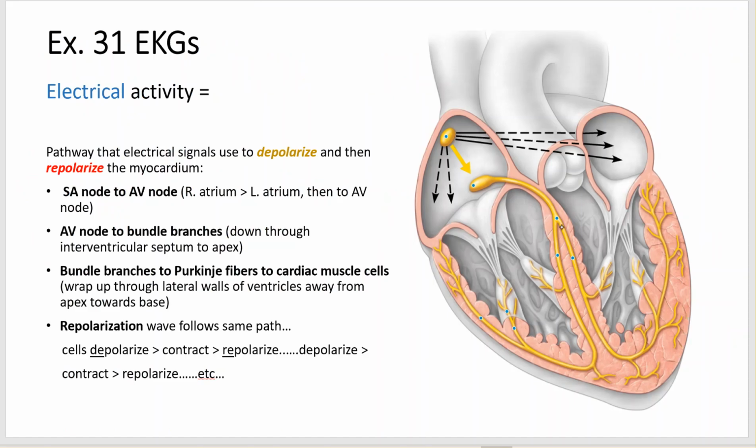So here we have left, oh, sorry, I don't want that. I want my pen. There we go. Left bundle branches. So if my signal is going down my left bundle branch, fine, but the signal is somehow not really getting that far, and by the time this one gets all the way down here, this one is still way up here. How might that look on an EKG?